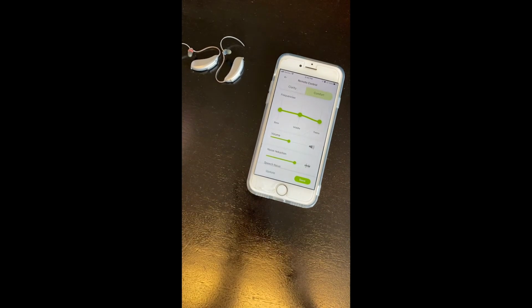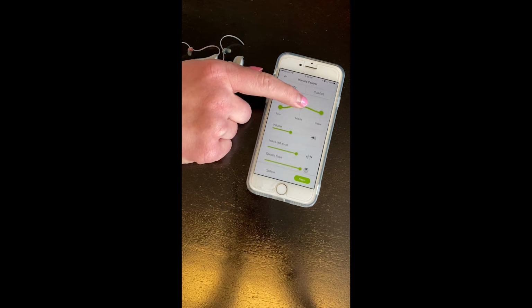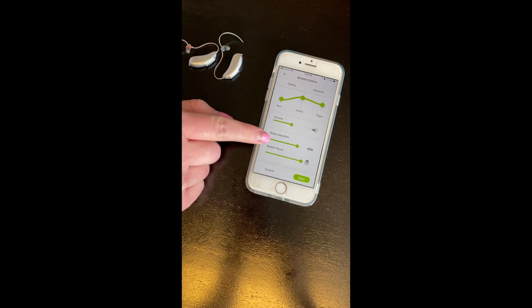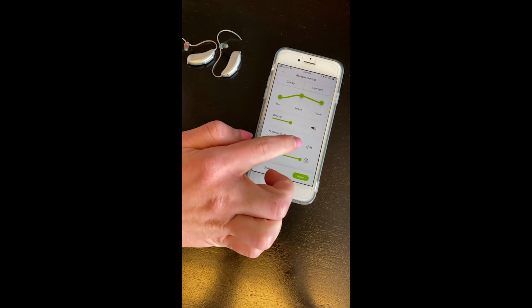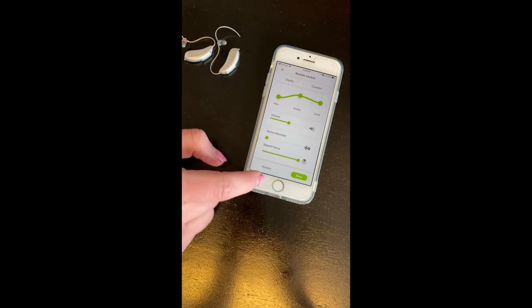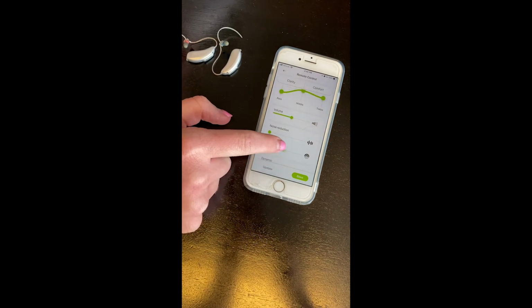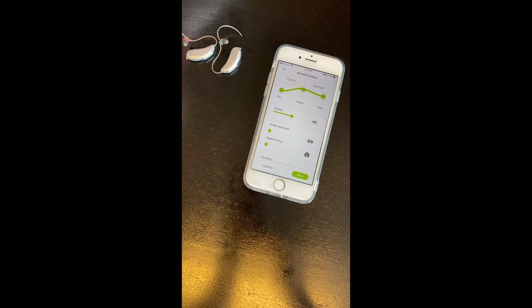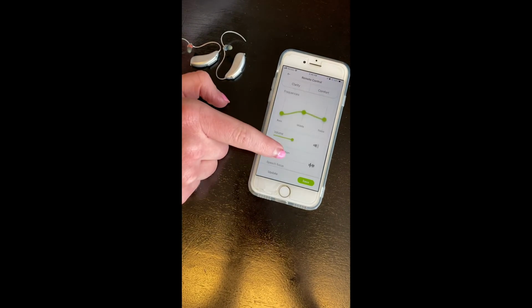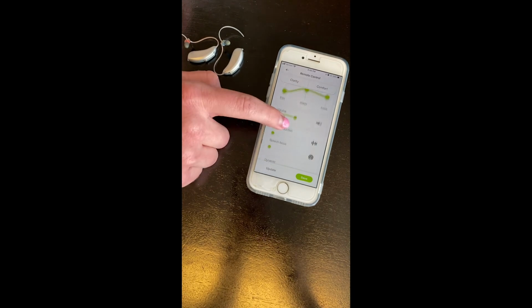Okay, if you press that down there, you can always adjust things yourself. You can turn up bass, you can turn it down, you can turn up and down middle volume and the treble. You can turn up and down volume, turn up and down noise reduction, which what that does is if you turn it up, it takes out more noise. If you turn it down, it doesn't take out as much noise. And then speech focus right now is all the way up, which means we're focusing in on speech. And then if we take it back, then it doesn't focus as much on what's in front of you. And then dynamic, you can decrease loud or increase soft. My recommendation with this is only use it if you're in a situation where you need a little extra help. And then you can just play around with it.